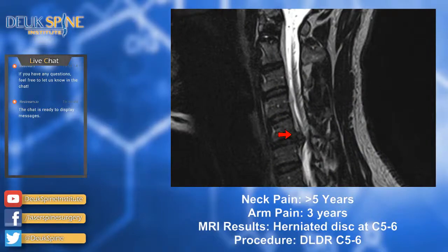We're good here. Just leave it there. Do you have a snap or anything? No? Here. You don't need this, right? So he traveled all the way from Canada here to Florida for the Deuk laser disc repair. All right. Are we relaxed? Yes. Blood pressure is good? You can bring it up a little if you want. So, hold on, I'm not ready yet.